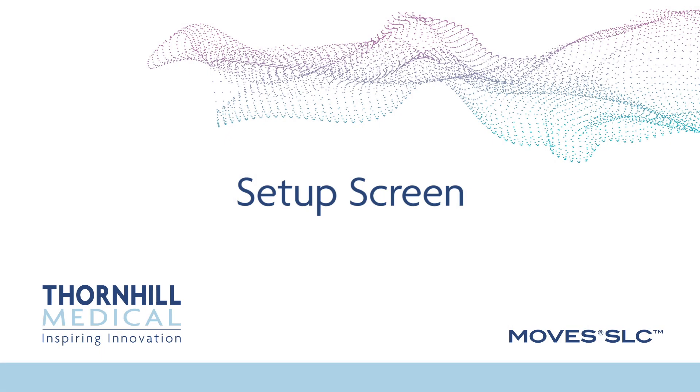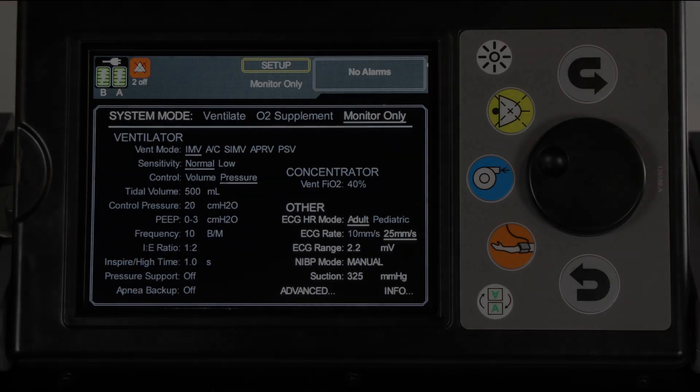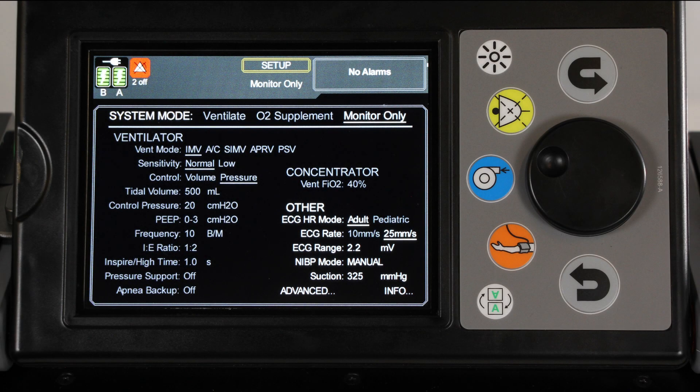And the ECG screen to display up to 12 graphs. The Setup screen is displayed once the device has been turned on and the system tests have passed. The Setup screen is also accessible from the Screen Select button at the top of the screen. When the device is turned on and configured for a new patient, the default system mode is monitor only. The selection of a system mode will grey out certain settings that are not relevant to the current mode, but these settings can still be modified.